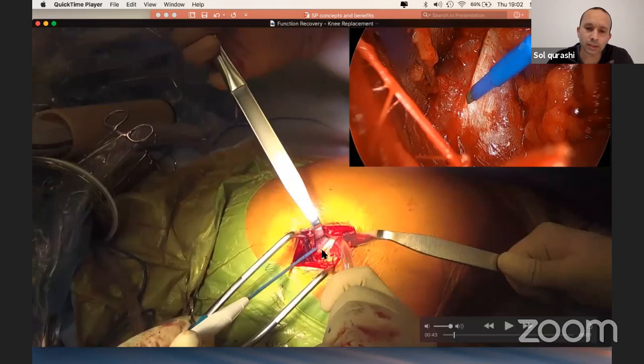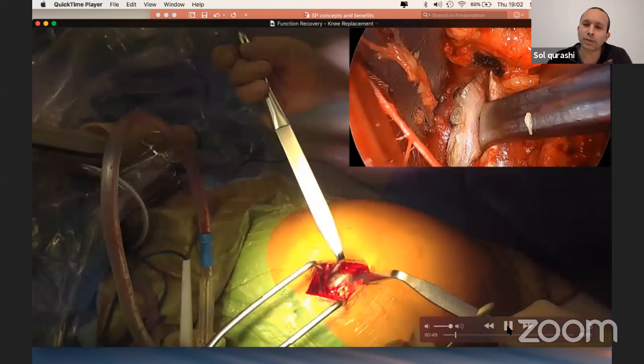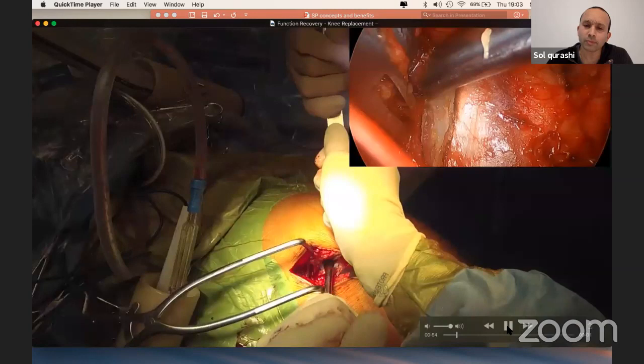So piriformis, minimus, usually piriformis goes underneath, minimus goes underneath piriformis a little bit. So I'm just gonna cut this fascia a little bit just to allow me to mobilize my minimus. And once I've done that, I'm going to try and sweep that minimus anteriorly and piriformis posteriorly a little bit. And you can see the capsule underneath it, that white structure is the posterosuperior capsule. So I'll hold that minimus anteriorly with a Langenbach.